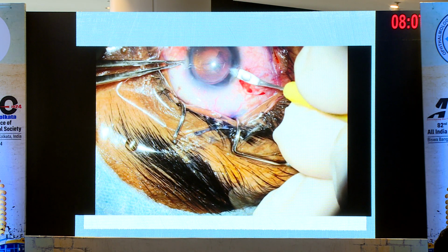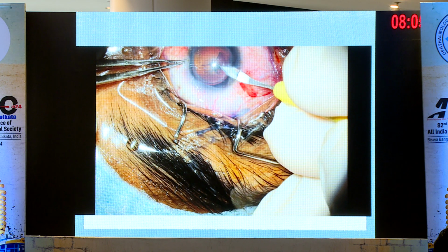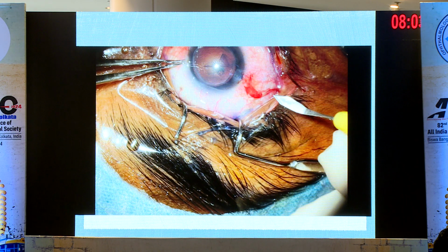When doing phacoemulsification after a DSEK, you have to keep some things in mind. One is your entry wound. If your graft is well centered, then it may make sense to do a scleral tunnel, and always try to enter outside your graft.